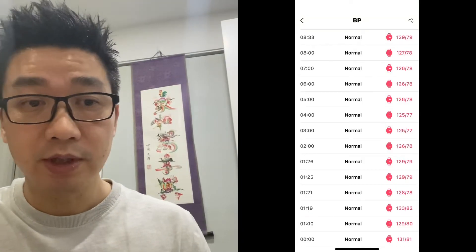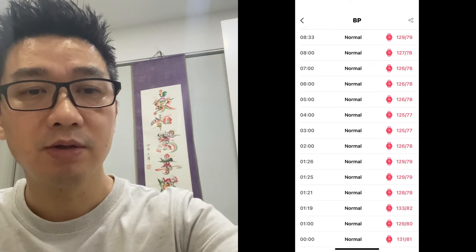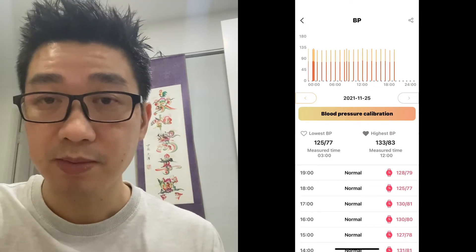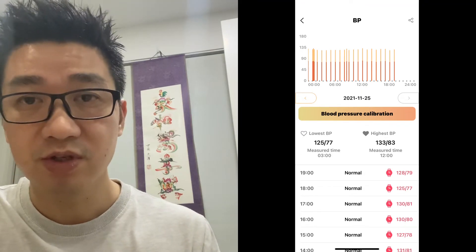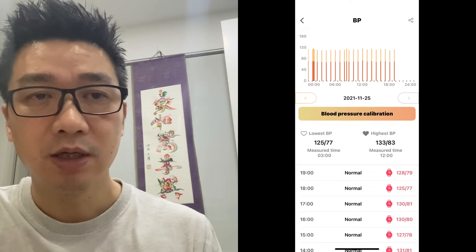Here's what's really good — it's a tracker you wear on your arm. You can sleep with it, you can have it on all day, and it will measure your blood pressure every hour. So you've got blood pressure readings all through the night when you're asleep and all through the day during your activities, so you can see how your blood pressure changes based on particular activities. Here are my readings from one o'clock in the morning all the way to eight o'clock, showing the lowest at three o'clock in the morning and the highest at twelve o'clock.